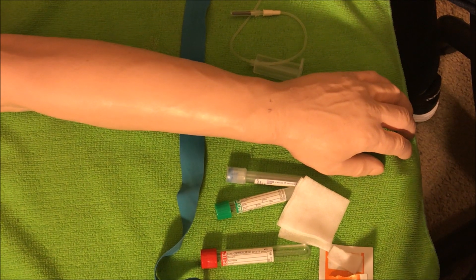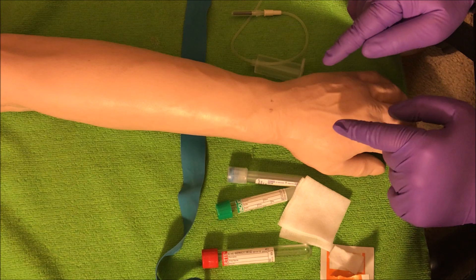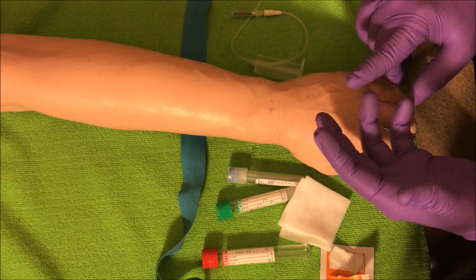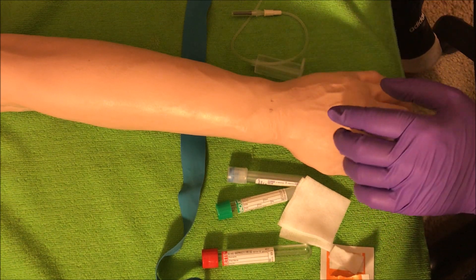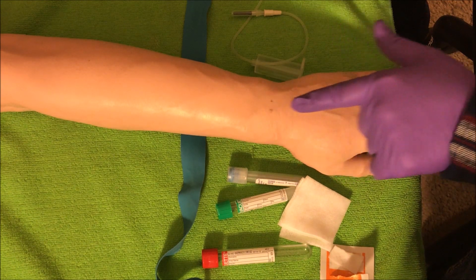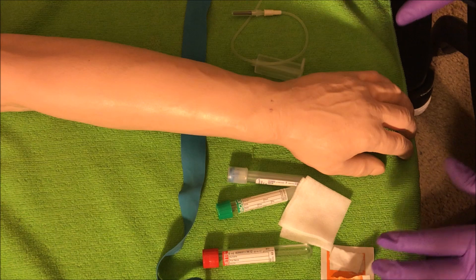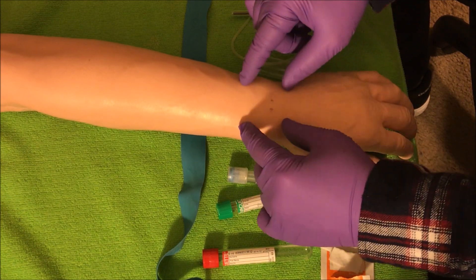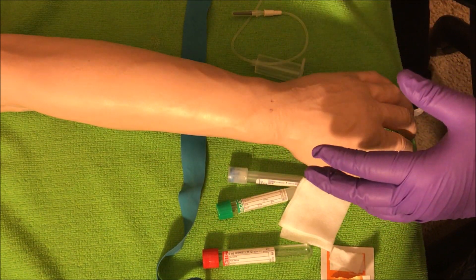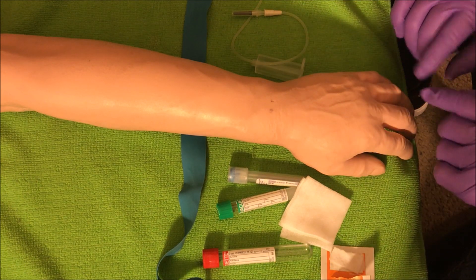Let's talk about drawing from the back of the hand — which veins and how we do this. As far as steps and procedures, nothing changes except for one thing: the veins. There's no order of veins here as we had at the antecubital fossa — the median cubital, cephalic, and basilic. Here we just have the dorsal metacarpal veins, running from the knuckle up to the wrist area. There's no specific order; we can draw anywhere between the wrist down to the knuckle. We cannot draw on the inside of the wrist or along the knuckles — those are off-limits. CLSI standards only allow us to draw at the dorsal and wrist area. These veins come from the basilic, median cubital, and cephalic veins, interchanging and connecting to form the dorsal metacarpal veins.